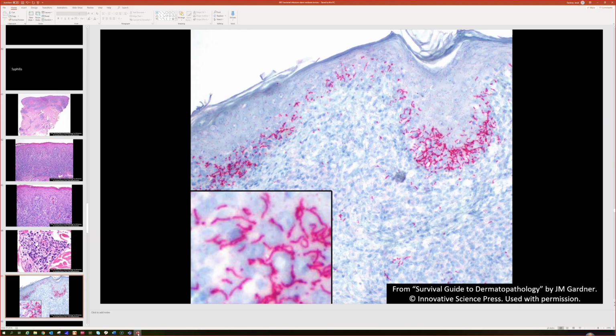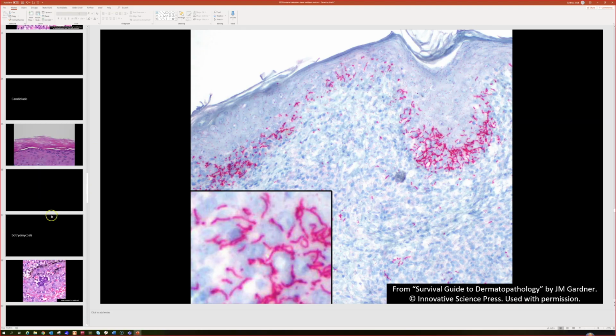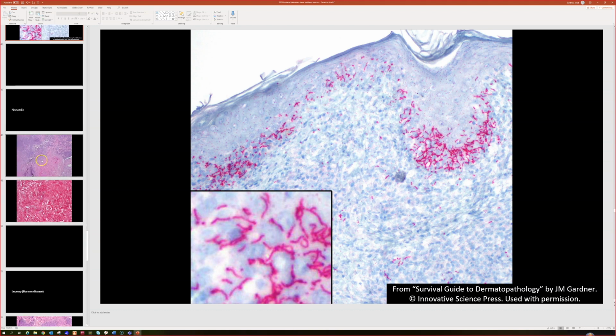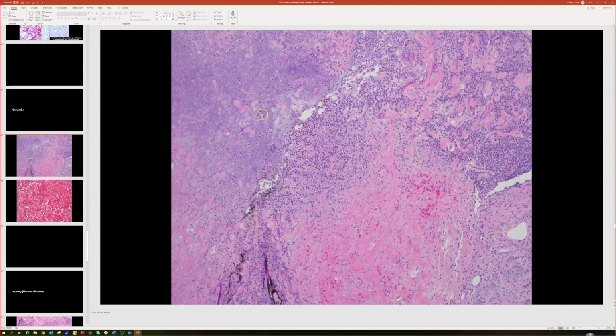This is supposed to be nocardiosis or nocardia, and I will just show you one example. I've only rarely seen nocardia. Here was an example I saw. This one had extensive necrosis and tons of neutrophils. Obviously looked like infection. This patient had multiple ulcerations of the leg. I think they were immune compromised, but I can't recall the exact story. So obviously we were highly suspicious for infection here on this case.